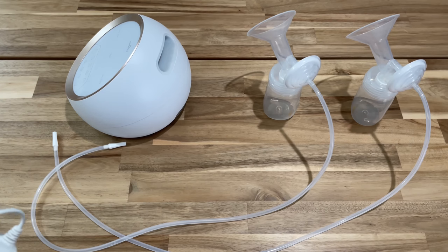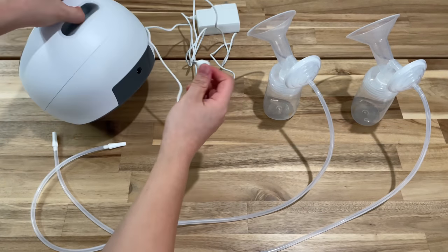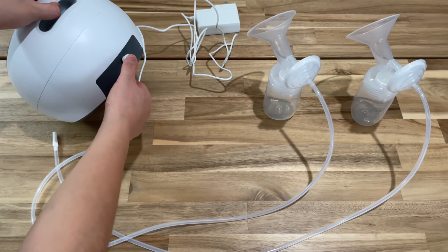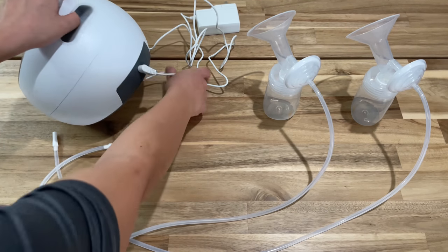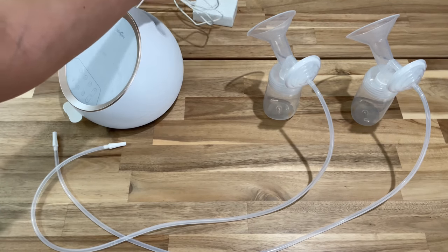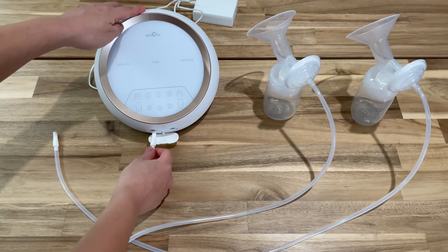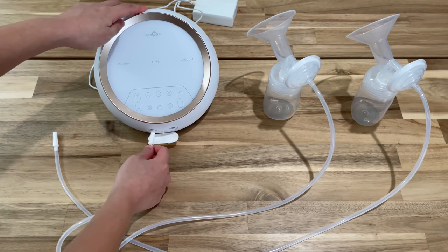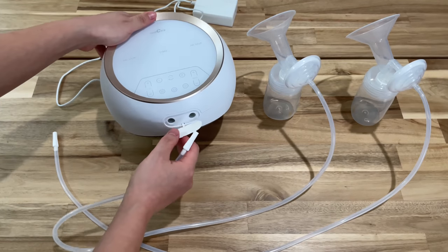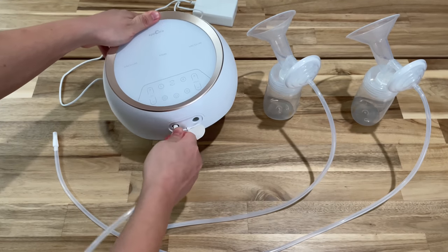Next is to connect the pump kits into the machine. This is the adapter, and it connects at the back of the machine pump, and then goes into the outlet. For the pump kit tubing, they go into the holes you see here — just wiggle them all the way in.